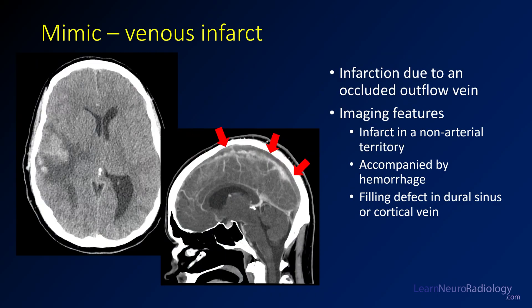One thing you need to look for is venous infarct — particularly if you have areas of peripheral hemorrhage or unusual vascular territories. Atypical patients like younger women with coagulation risk factors such as birth control pills or coagulopathies should raise suspicion. These areas of infarct are due to occluded venous outflow — they may not be in an arterial territory and often have hemorrhage. In this case, angiographic imaging shows a long-segment thrombus extending in the superior sagittal sinus coming all the way back to the torcula. Keep that in mind with atypical stroke presentations — look at the veins and make sure you don't have a venous thrombus.